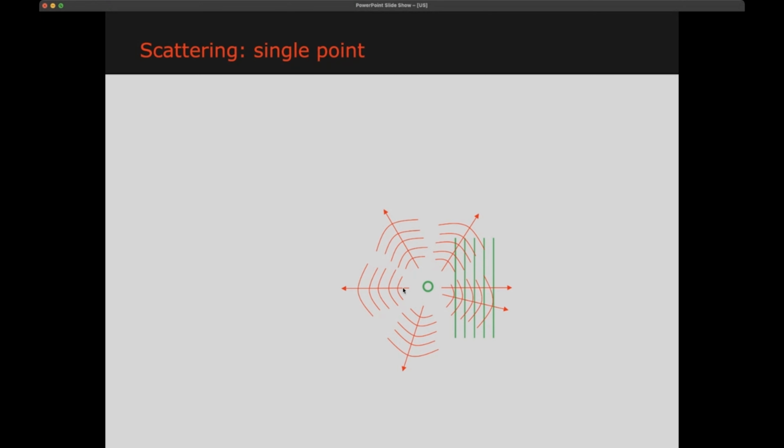That means that part of the energy is being transmitted back, but an equal part is transmitted in all directions and is even propagated further, towards where the wave travels on. This is what we call a scatter reflection. So a small object is actually scattering the ultrasound, and it will act as a spherical transmitter, and will also transmit energy to the transducer.